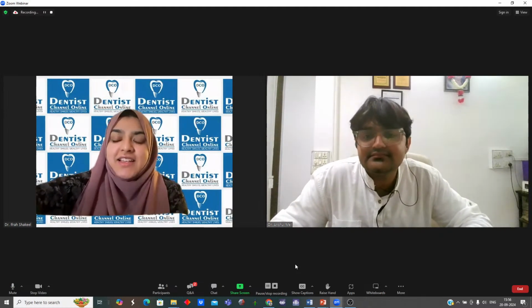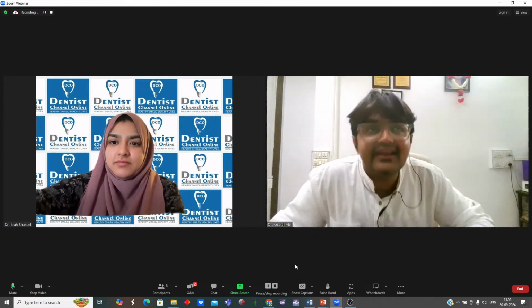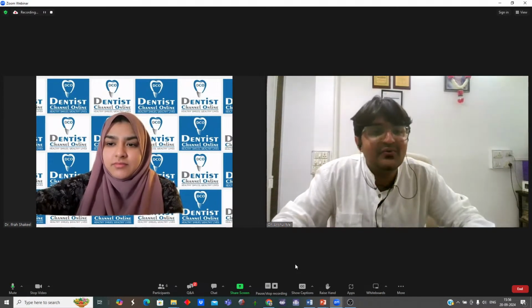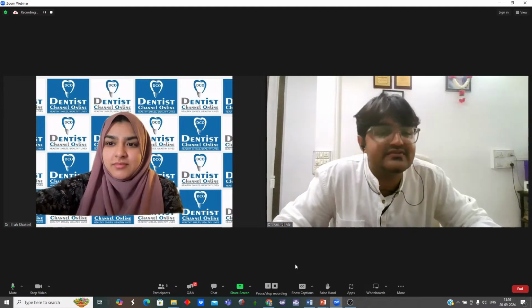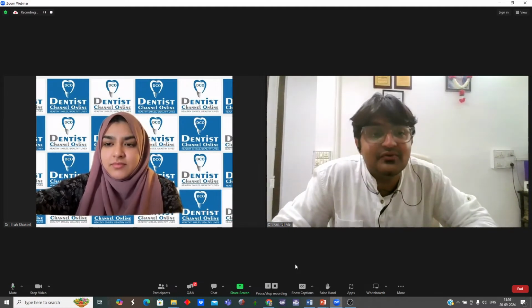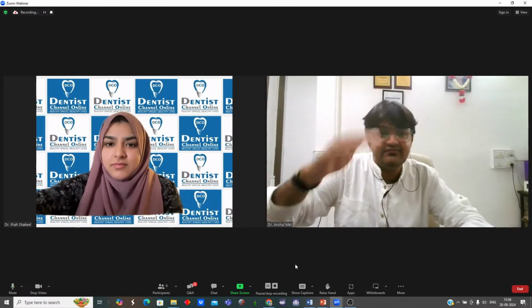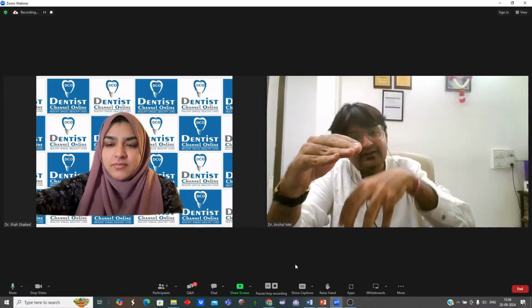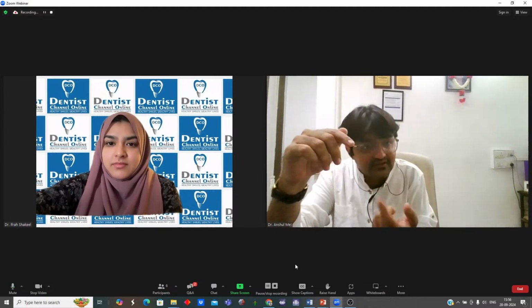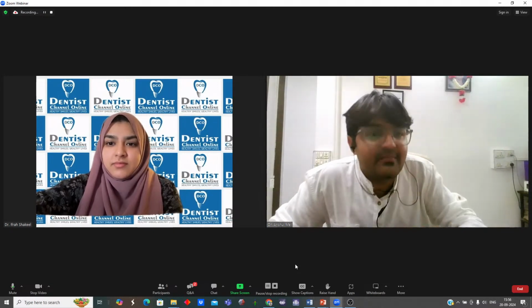All right. There's another question, doctor. What is the prognosis of direct maxillary sinus lift followed by immediate implant placement? Direct sinus lift will depend on how much bone you are getting and which kind of bone graft you are using. For that we are doing immediate loading. Right now what you are doing is lifting the sinus, placing the bone grafting material directly and then inserting the implant. But in the crestal layer, you require at least 2 to 3 mm of bone to get primary stability of your implant.